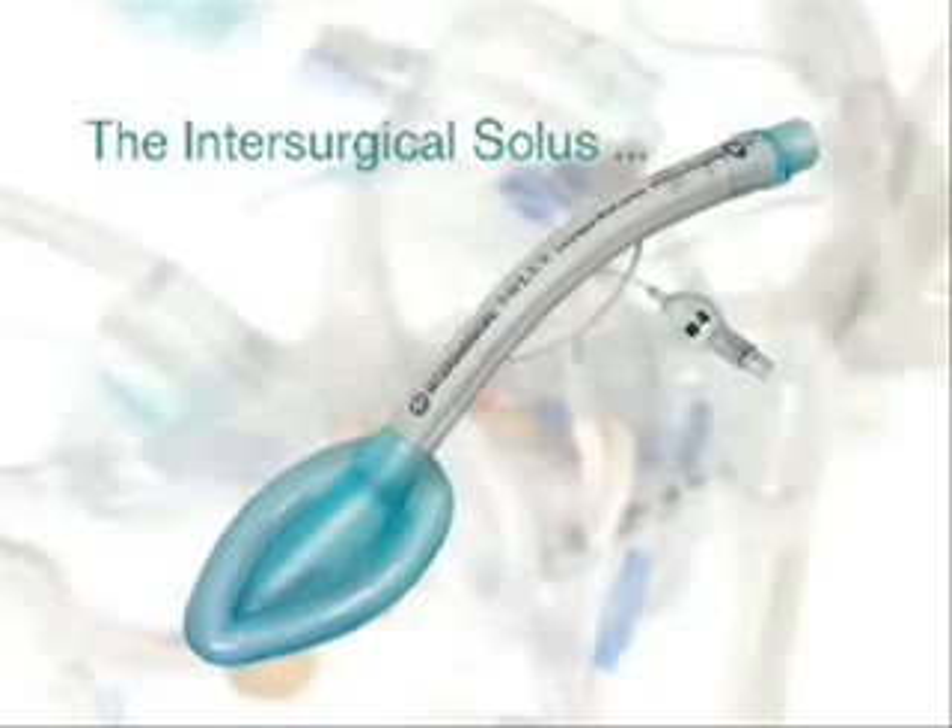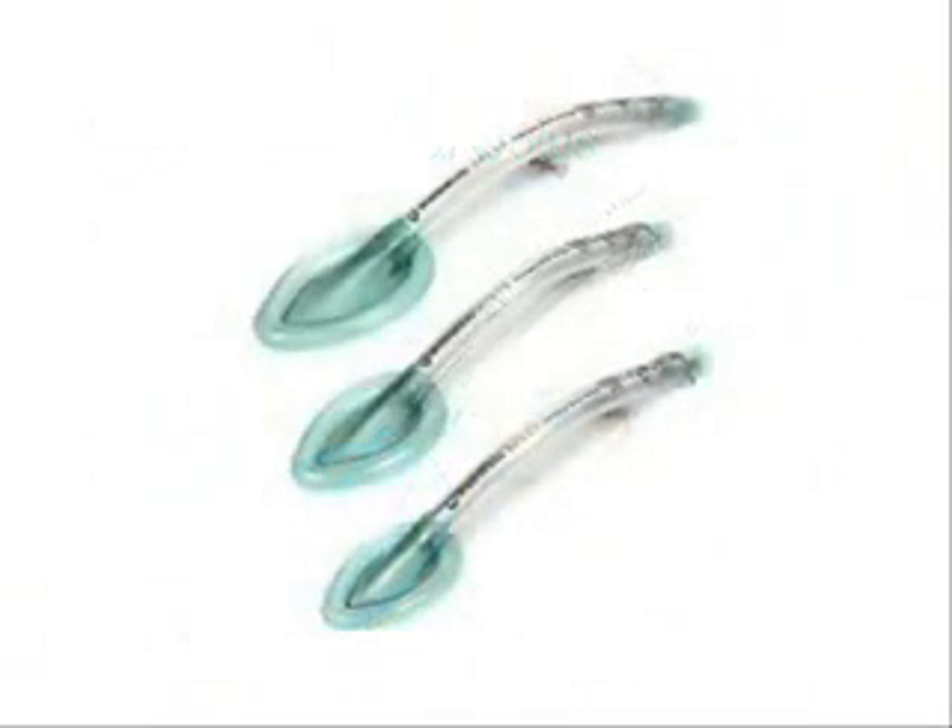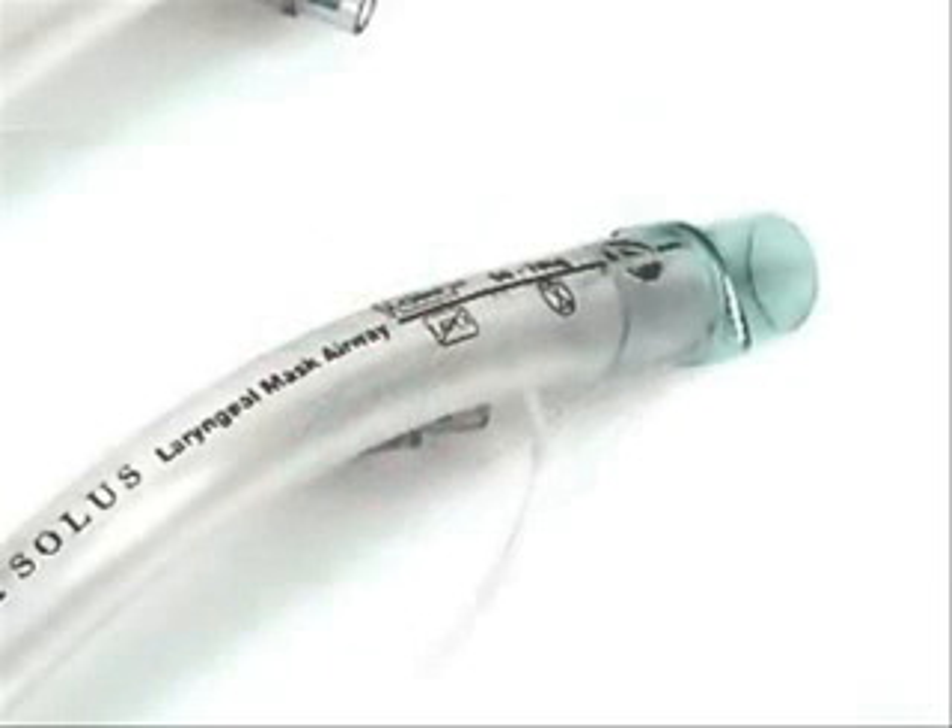What we are about to demonstrate is the correct insertion technique for the Intersurgical Solus Laryngeal Mask Airway. Firstly, it is important that you select the correct size for each patient, and the patient weight does appear on the airway tube.